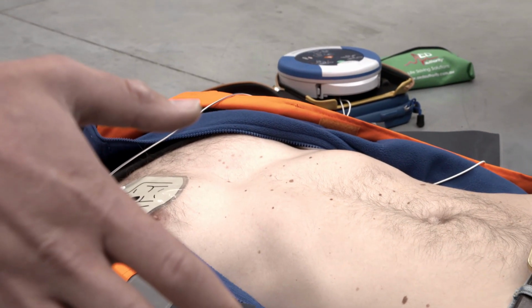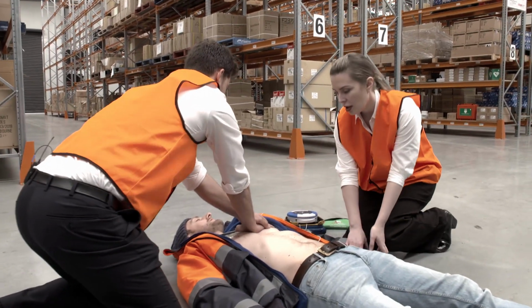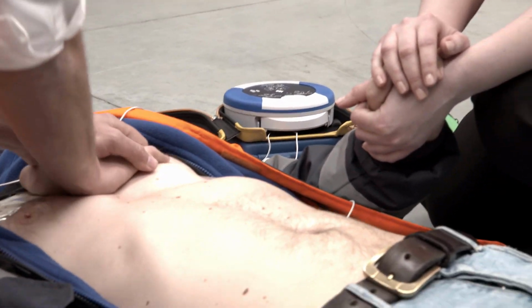The 500p will then advise if another shock is required. Continue providing CPR until either the patient regains consciousness or emergency services arrive.